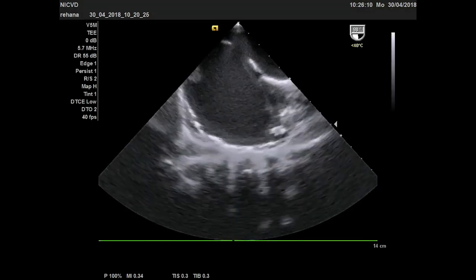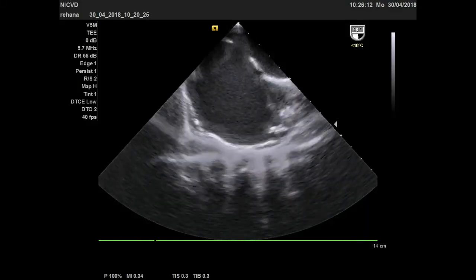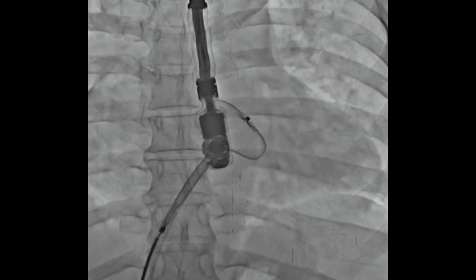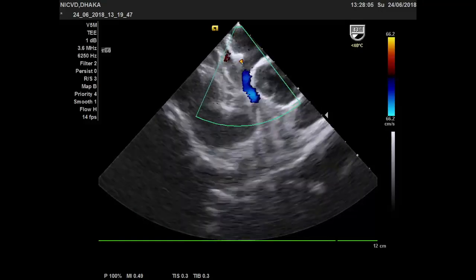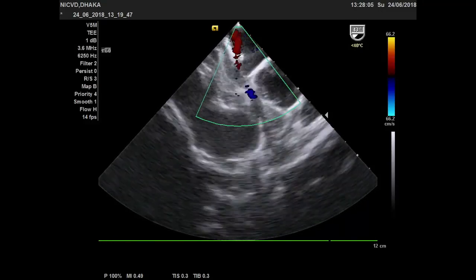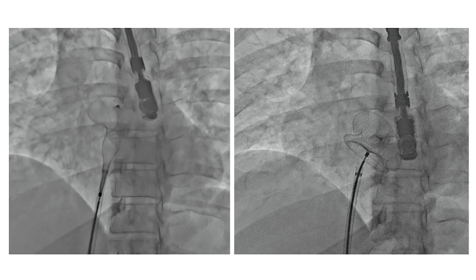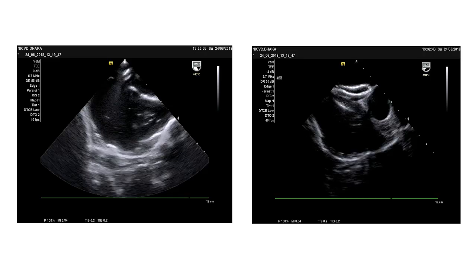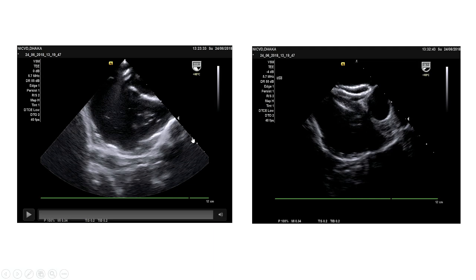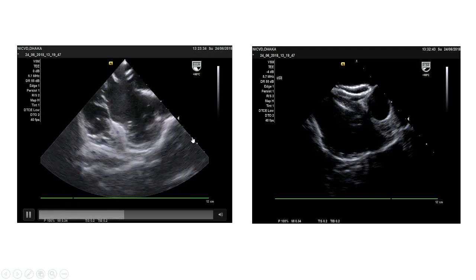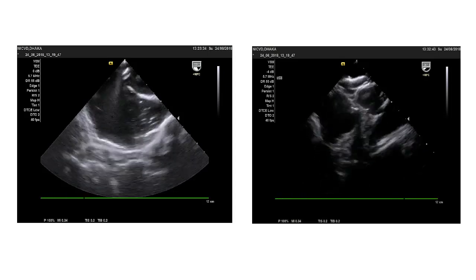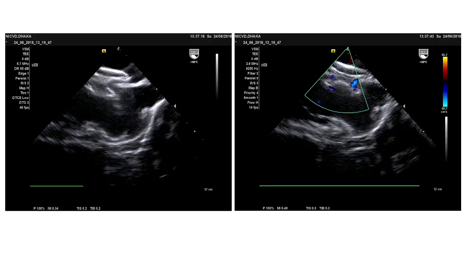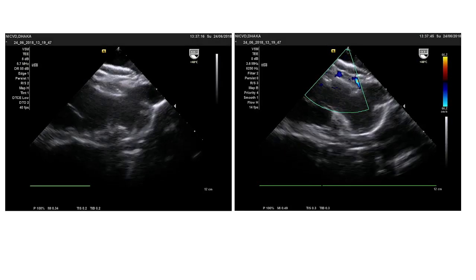These are two ASDs separated — one larger and one smaller. We pass through and engage the catheter, but here we are probably through the smaller ASD, so there is a residual leak. Then we reposition the guide wires and here is the position of the device through the larger ASD. It is sure that it caught all the ASD rims, all the ASD is covered, so we release the device — there is no residual.